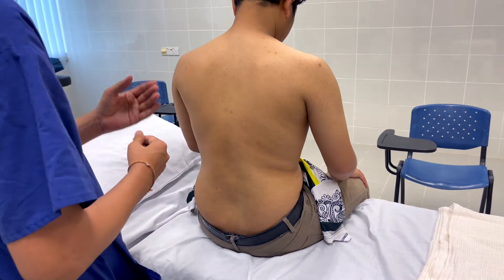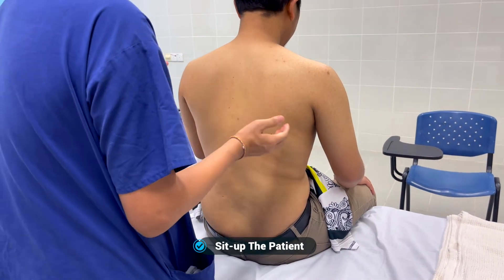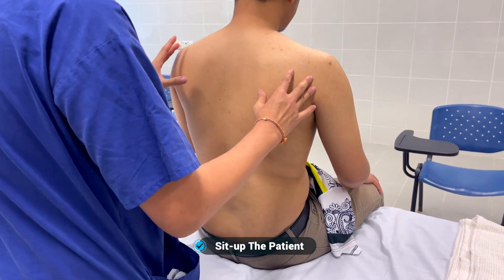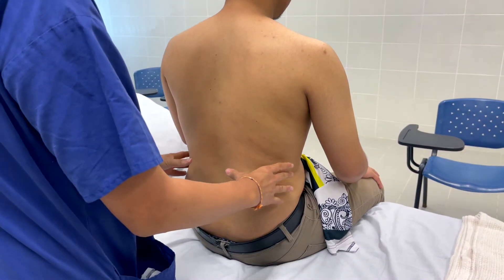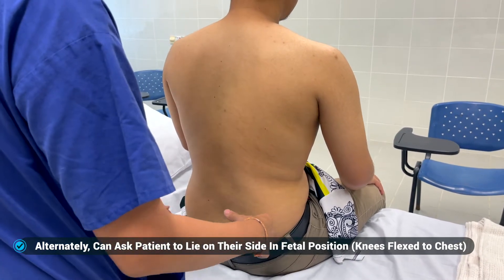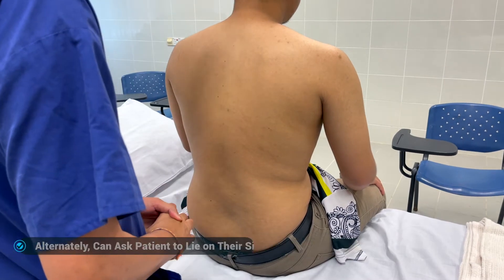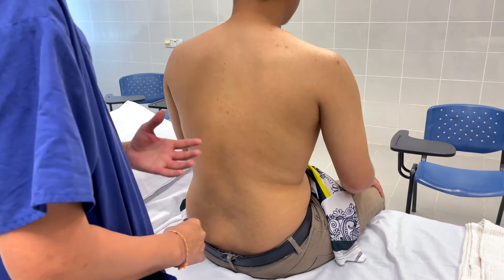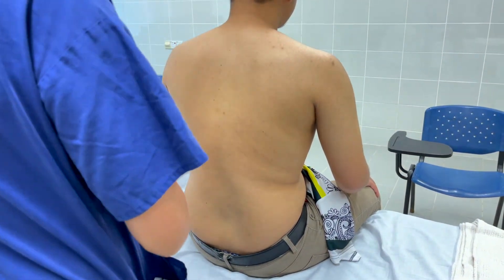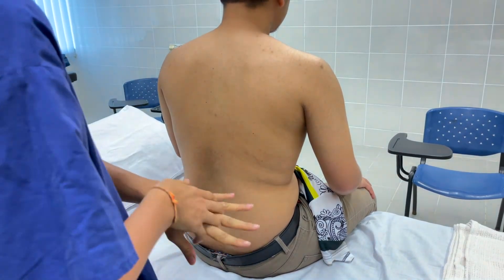After we have gained consent from the patient, we will make sure the patient is comfortable and in a sit-up position. The patient should be exposed at the back, down to the bottom, to expose the lumbar area. We tell the patient that we will be identifying the posterior superior iliac spine. Prior to touching the patient, we must make sure our hands are clean.